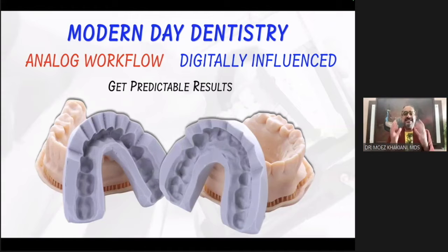Because your patient's aesthetic profile or their aesthetic understanding was more for the temporary. But your final is not the exact same. क्यों temporary कोई और technician ने बनाया, final कोई और technician बना रहा है. There is no copy paste with the analog world. But when I talk digital dentistry, what happens here is it is designed by a computer.